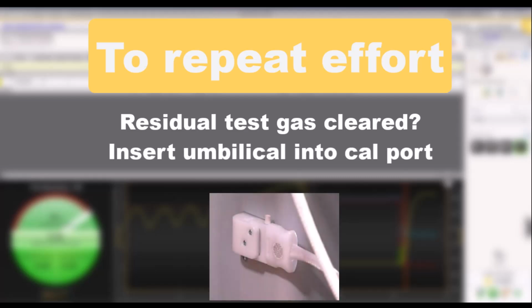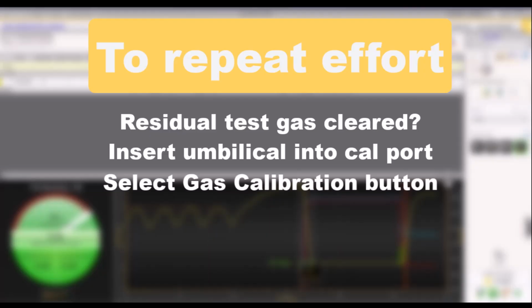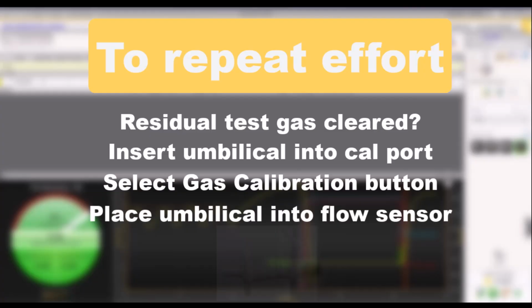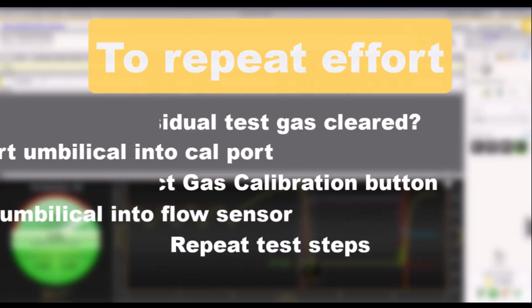To repeat the effort, insert the umbilical into the calibration port. Perform another gas calibration. An effort should be started within 2 minutes from the end of the gas calibration. Replace the umbilical into the prevent flow sensor. Repeat the test steps by clicking on the Start button.